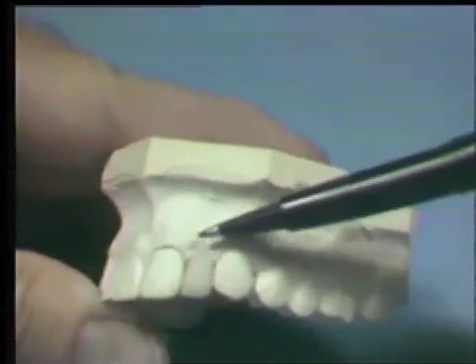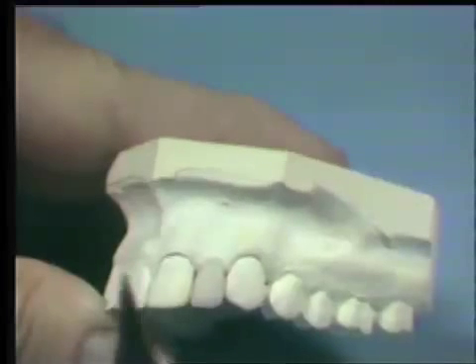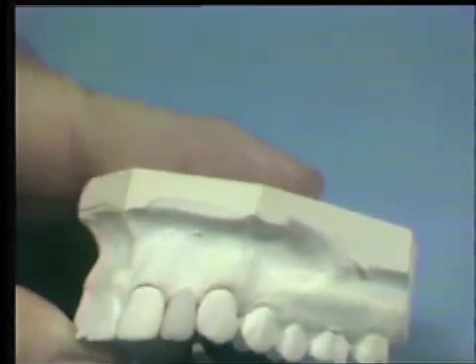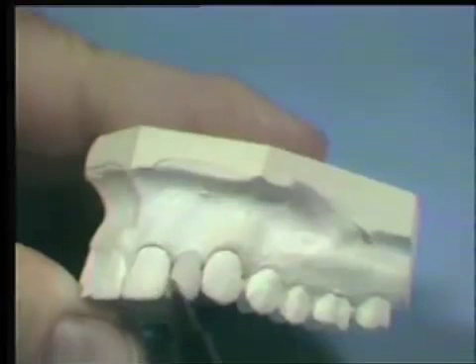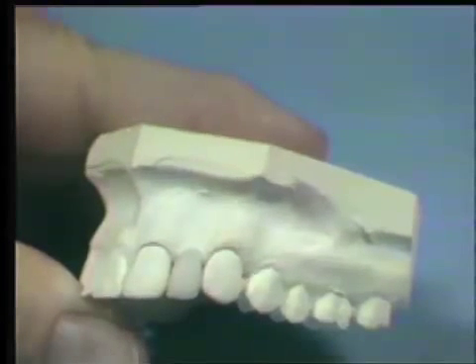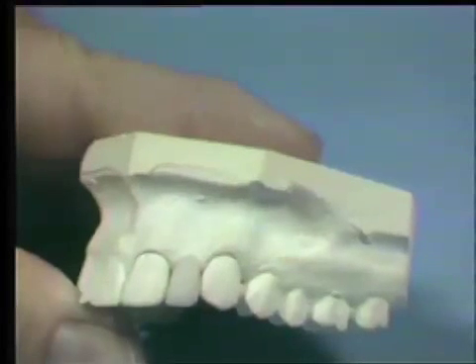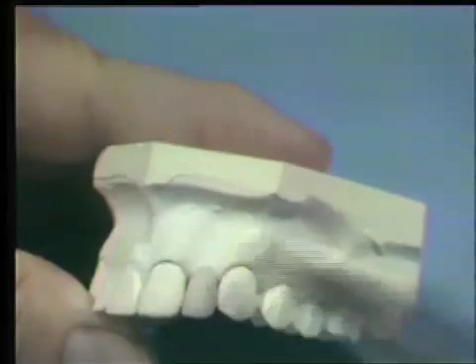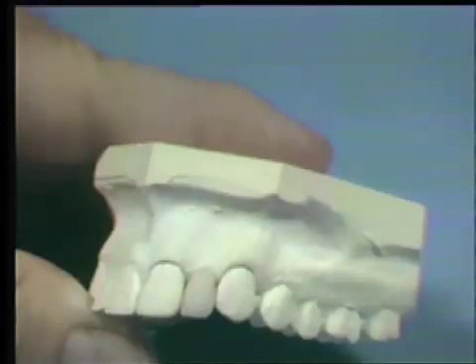We will now contour the pontic to its rough shape. We have rough ground the pontic to the general shape, size, and contour in harmony with the adjacent teeth, and now we are ready to do our final grinding and polishing. We have also contoured the metal surface as it approximates the soft tissue. It is extremely important that this surface be highly polished and follow the contour of the edentulous ridge, so that plaque will not accumulate and the undersurface of the pontic will remain in a healthy condition.